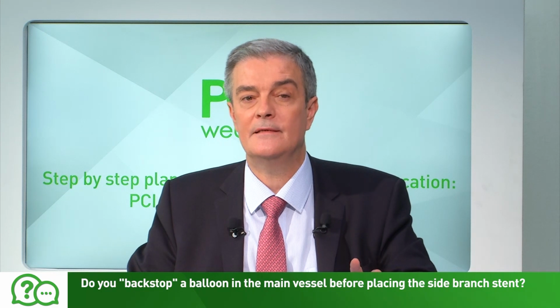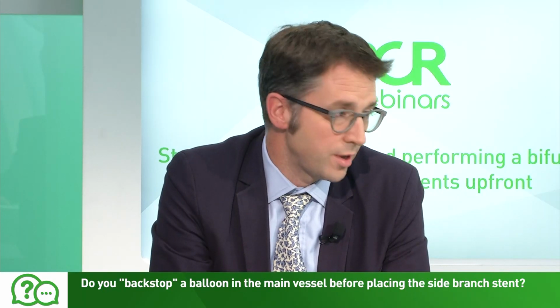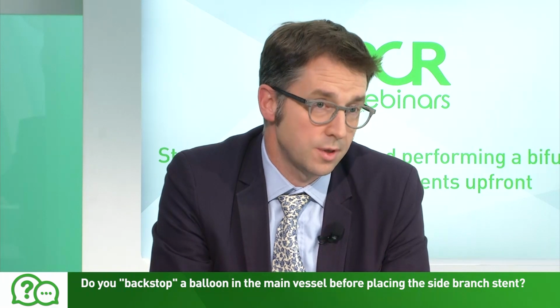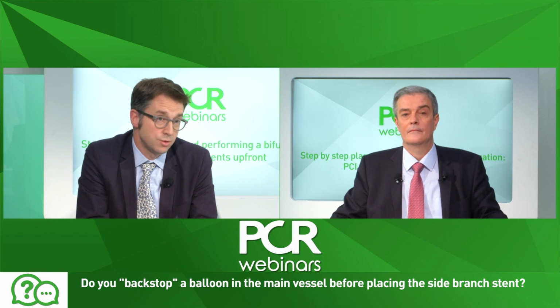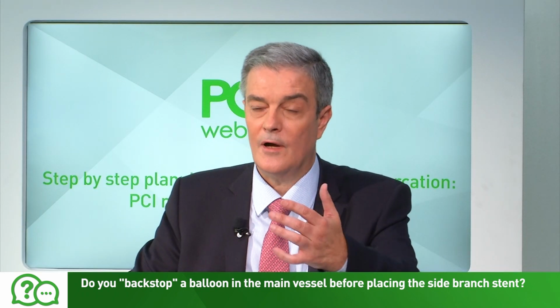Yeah, another question: do you backstop a balloon in the main vessel before placing the side branch stent? So Maciej has already highlighted that as a very important factor. The risk of deploying the side branch stent without equipment down the main vessel is that you then may not be able to get a main vessel balloon back down. So yes, you have a balloon trapped. Okay, other questions we can answer throughout the case.